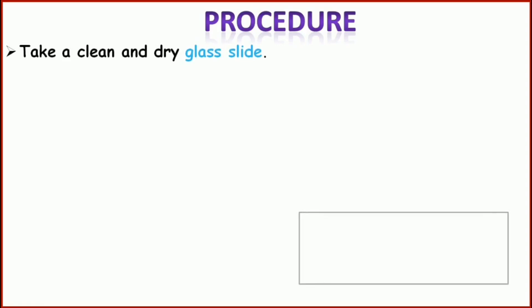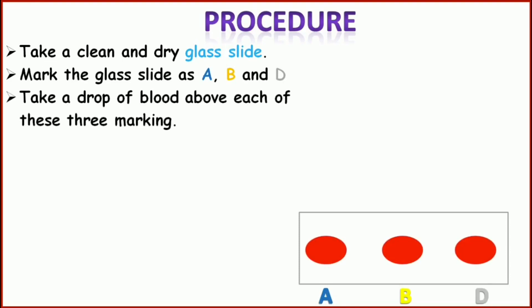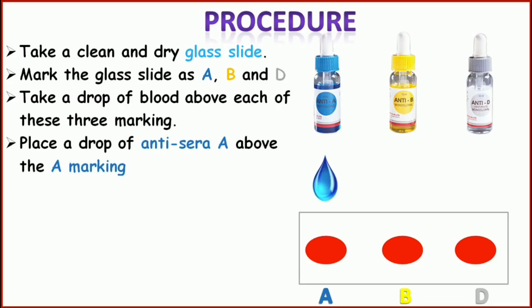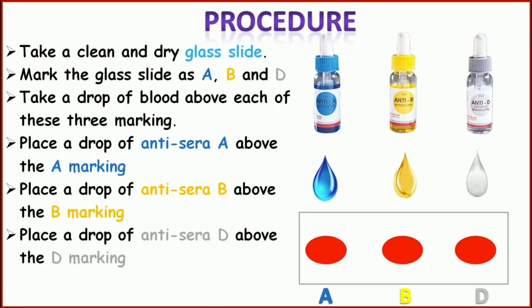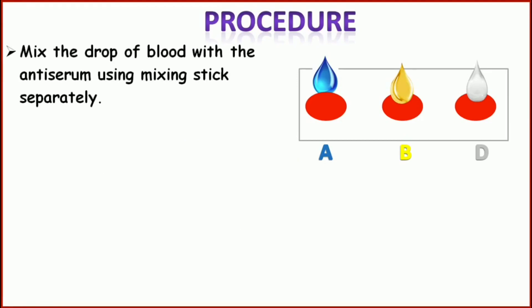For the procedure, take a clean and dry glass slide. Mark the slide as A, B, and D. Take a drop of blood above each of these three markings. Now place a drop of antisera A above the marking A, a drop of antisera B above the B marking, and a drop of antisera D above the D marking. Mix the blood with the antisera A using a mixing stick. Then with another mixing stick mix at the B marking, and again with another stick mix at the D marking. Do not use the same stick for mixing separate drops of blood.